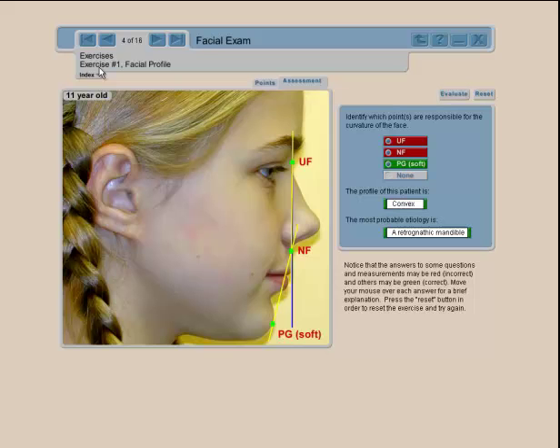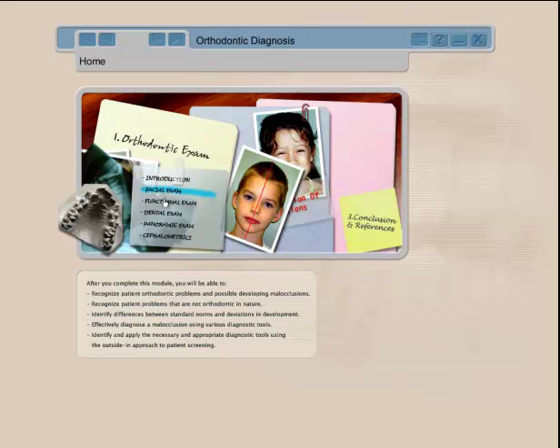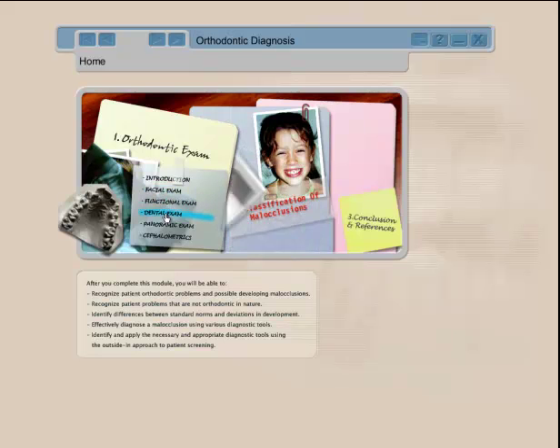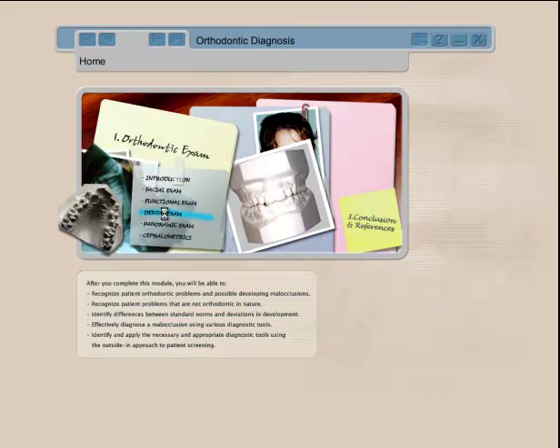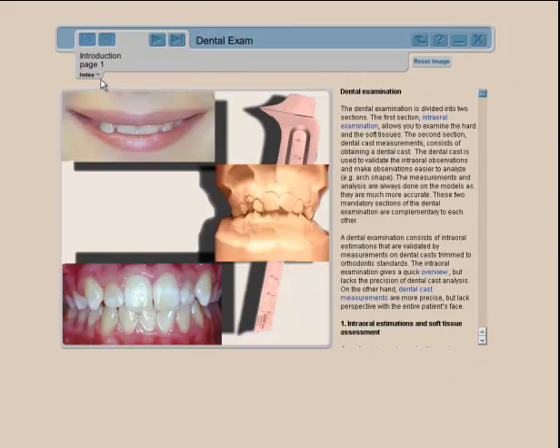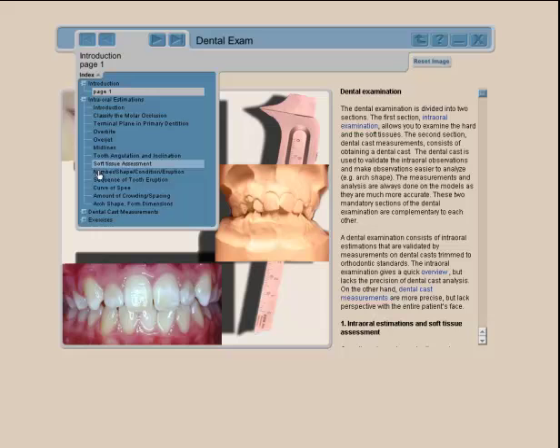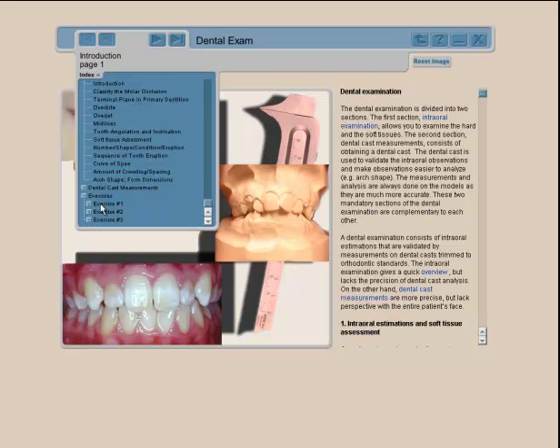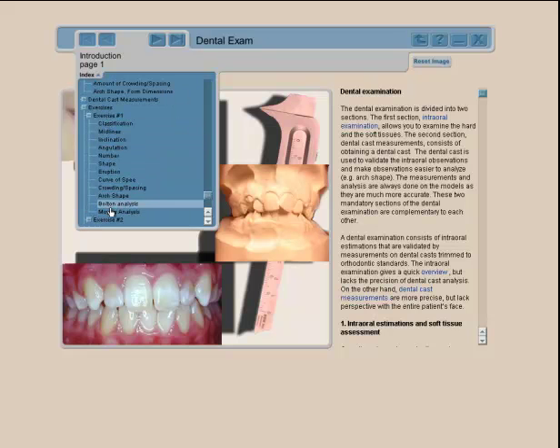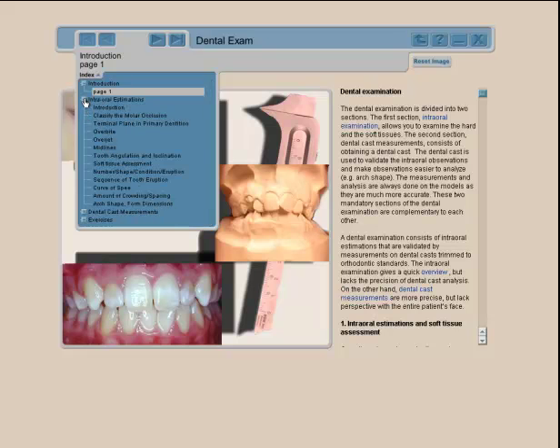Moving on, we can look at the program from another angle. The functional exam and dental exam follow the same concept. The dental section is an interesting tool — in the download you have the index again with intro, examination, and estimations sub-modules, plus exercises with the same sub-modules.